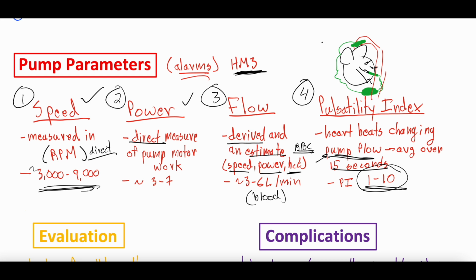And again, look for an upcoming video on all things alarms, because I think LVAD alarms are really important, but they're kind of next level. I didn't want to include them in the LVAD basics. I think they require a little bit more discussion on their own.